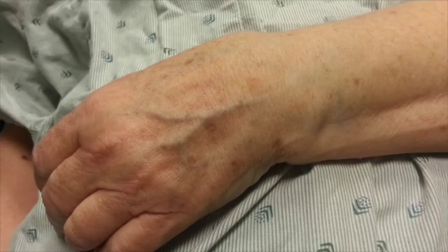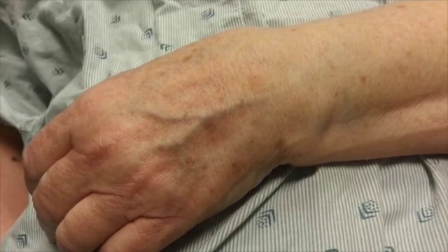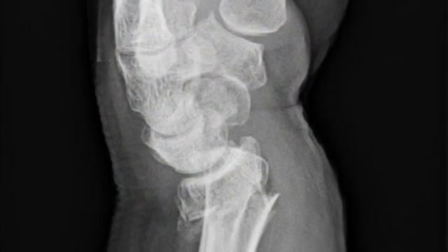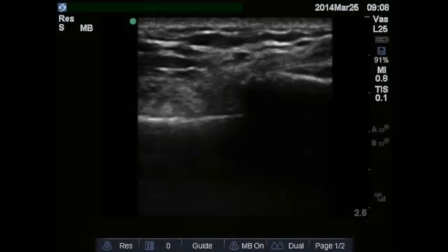Here we will focus on a very common fracture, the distal radius fracture. It looks like this on the patient, like this on an x-ray, and like this on ultrasound.